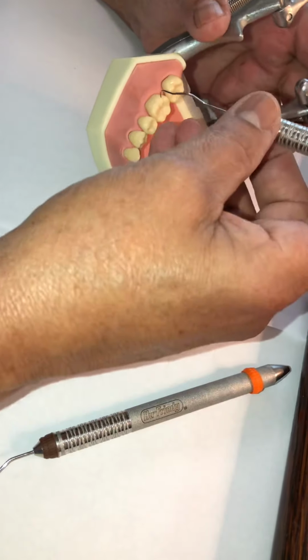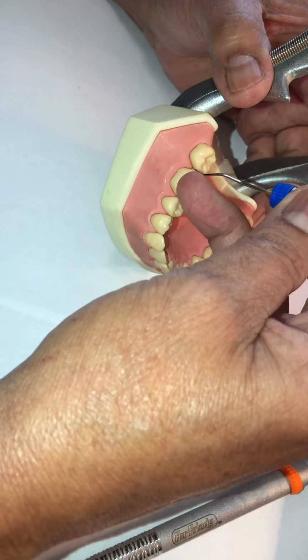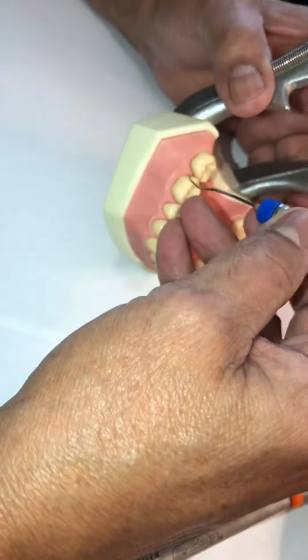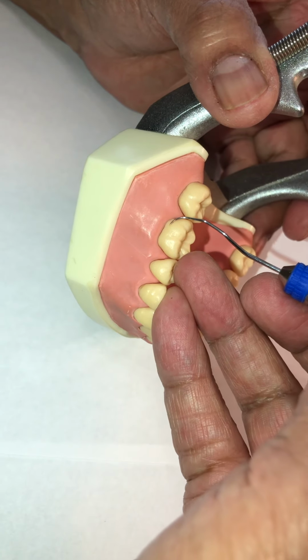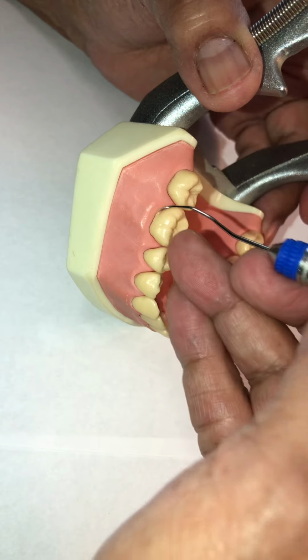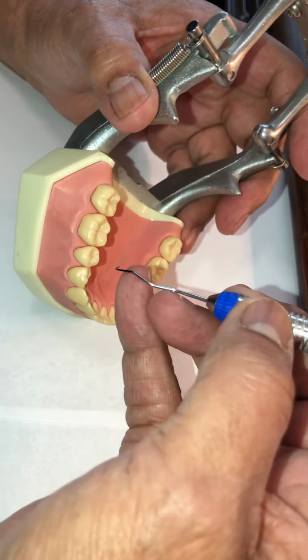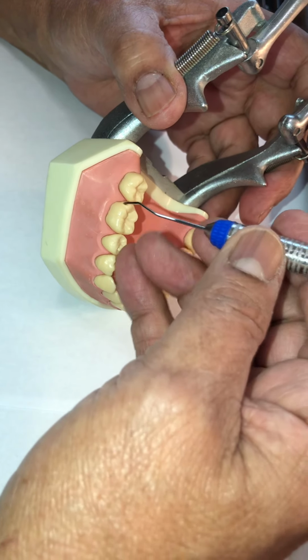Okay, so I'm going to find this first bend. If I place it right here, and I want to start on the lower right buccal, you can see that the bend is not going distal. It's pointing to the mesial. There it is right there. So that's incorrect. Now, I could probably make that work if I go around like this, but when I bring it around and flip it, you can see what that end does. See that working end right here? It's just scooping straight out. So that is not going to be able to adapt. By flipping it, this has to be my correct end, because that's the only other one I have to choose from. There, the bend is going towards the distal.